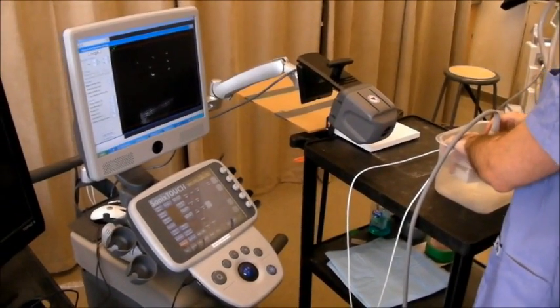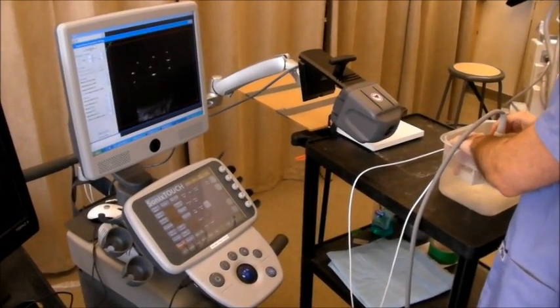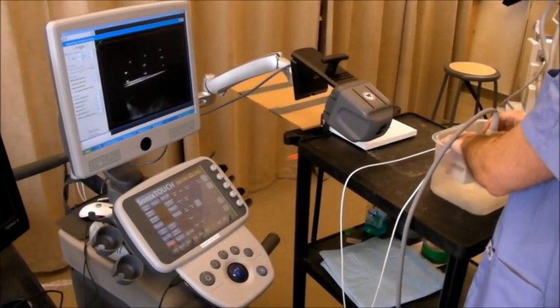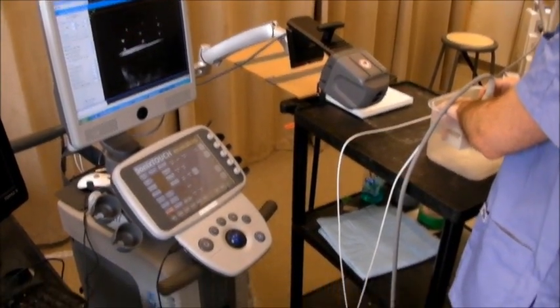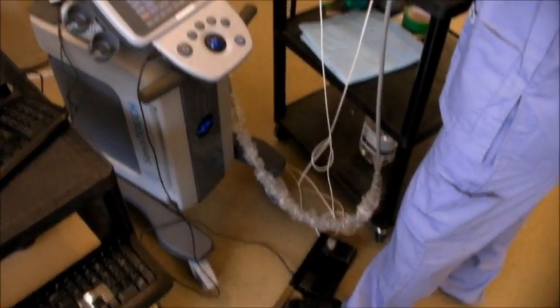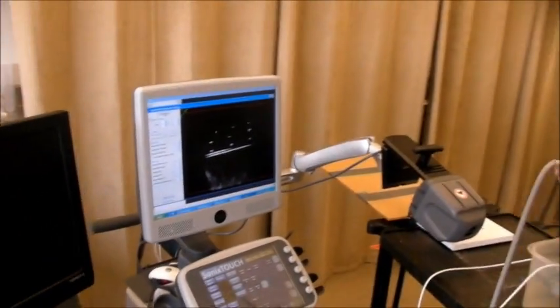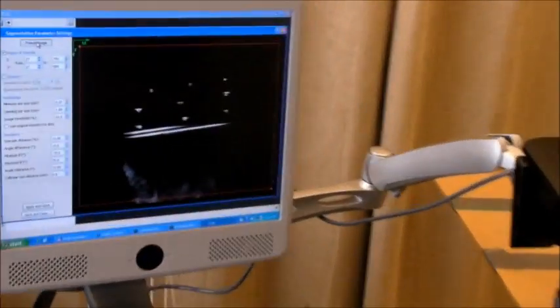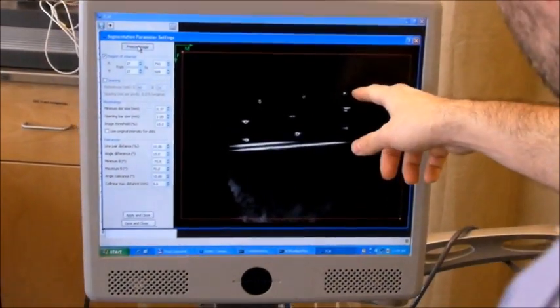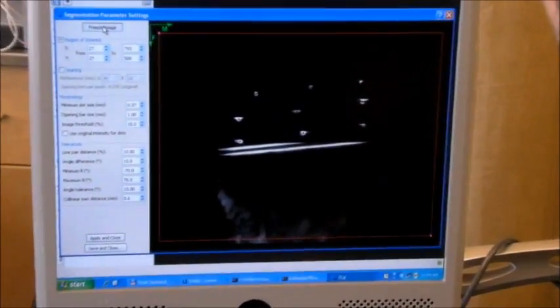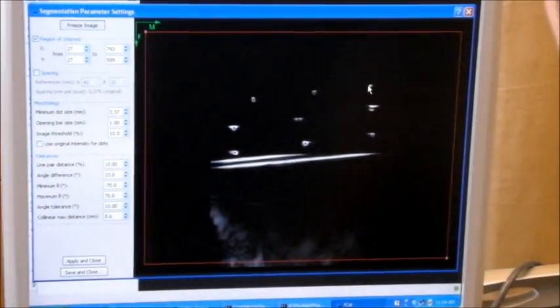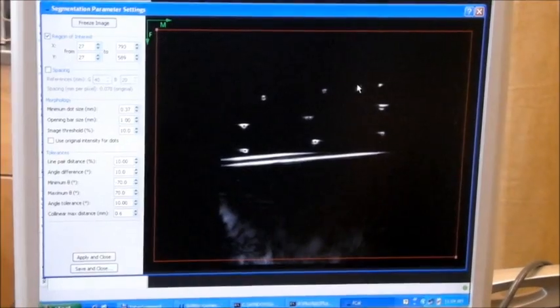I find a good image and freeze it. As you can see, the calibration is not successful at this point, because this wire was not segmented.